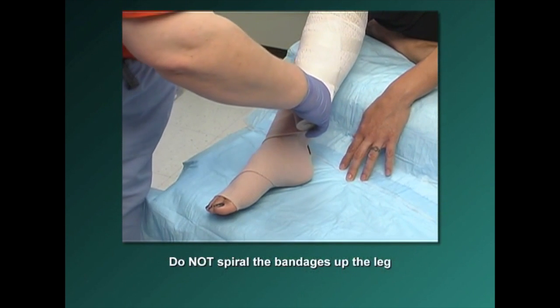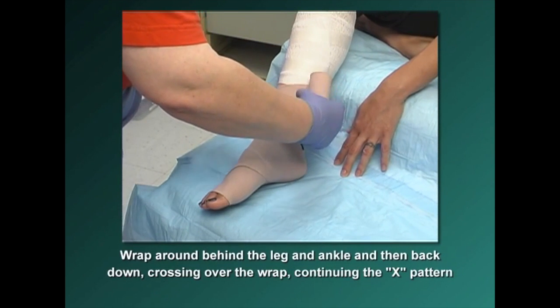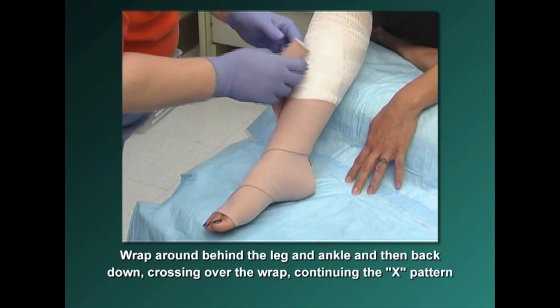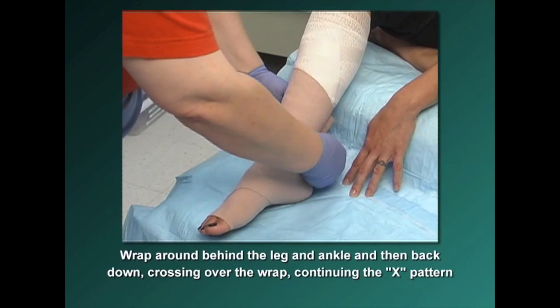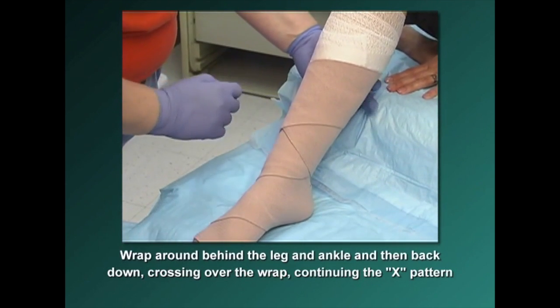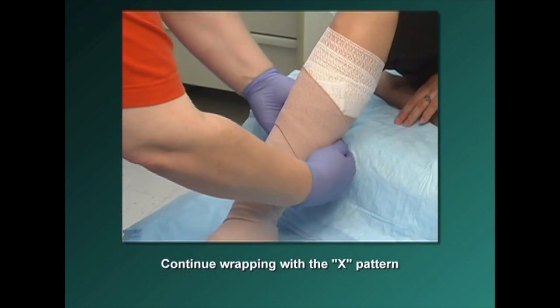Do not spiral the bandages up the leg. Angle up, straight across in the back, then come down in the front. Wrap the elastic bandage behind the leg and ankle and then back down the leg, crossing over previous wraps and continuing the X pattern. Continue diagonally with this pattern, up and around, down and around, until you have gone up the entire length of the leg.